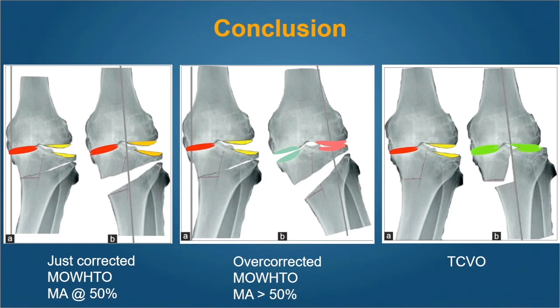So my request to you, or my hopefully take-home message, is let's look at each patient's x-rays individually and treat him as an individual. If you find a high MLDFA, then he needs a lower femoral deformity correction. But if the lower femur is normal, and you have a high JLCA and a high condylar plateau angle along with an extra-articular tibial varus, then you need to add an intra-articular correction as well.